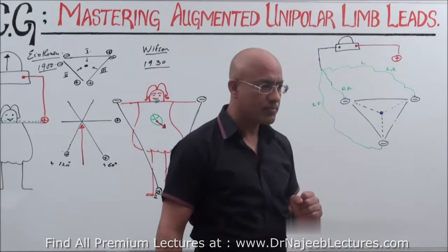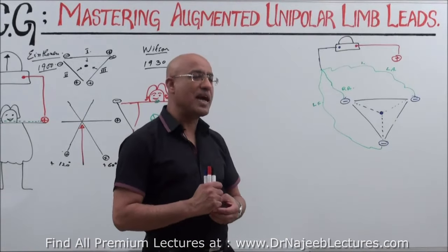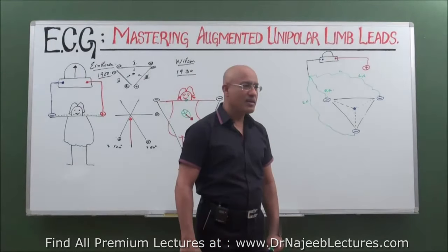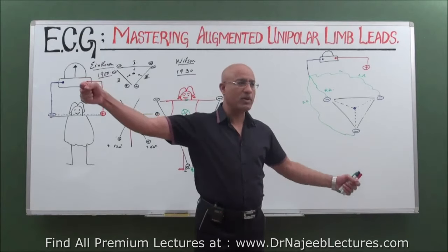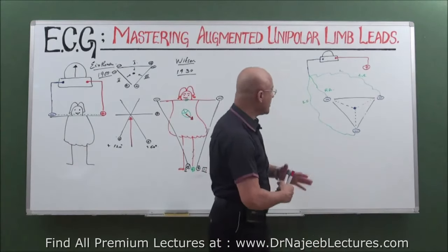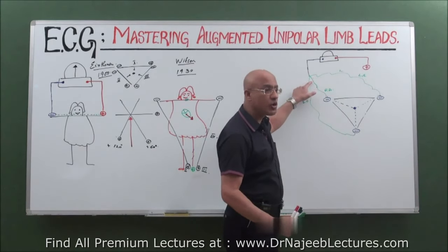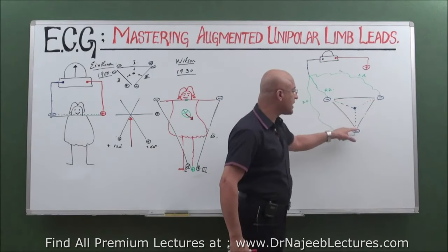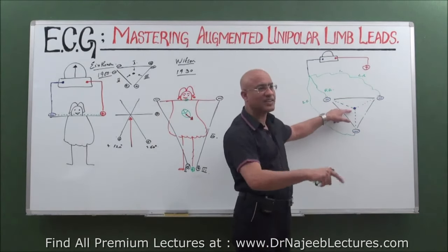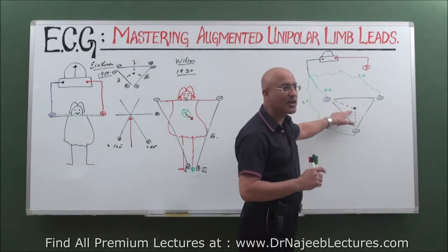Yes, what is your question? It is not a perfectly equilateral triangle. Wow, one of my students is super intelligent, same as one of Wilson's friends was. He said, Mr. Wilson, if you apply one electrode here, one here and one there, it is not a perfectly equilateral triangle. To achieve near zero potential, it has to be perfectly equilateral and the heart has to be perfectly in the center. Only then will you achieve a virtual electrode in the center of the heart with almost zero potential.